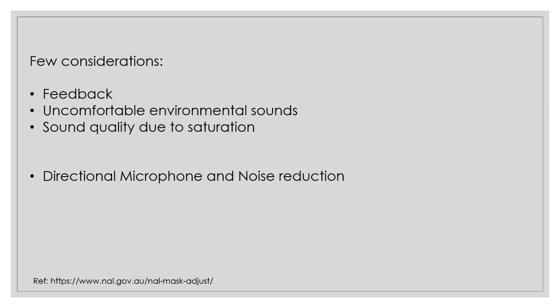The next is uncomfortable environmental sound. Because we are increasing the sound, we need to make sure that the other environmental sounds are not disturbing our usual hearing.